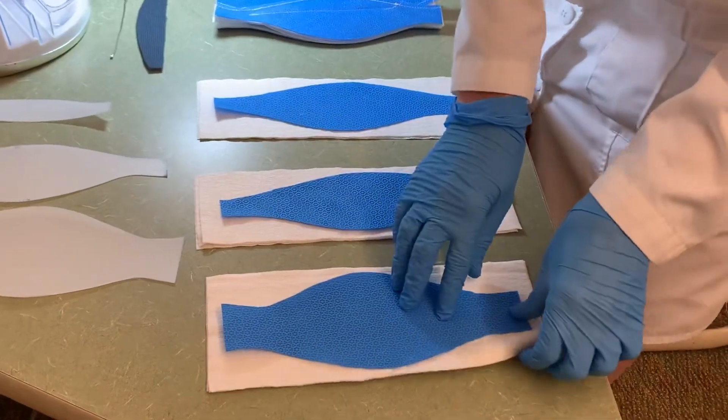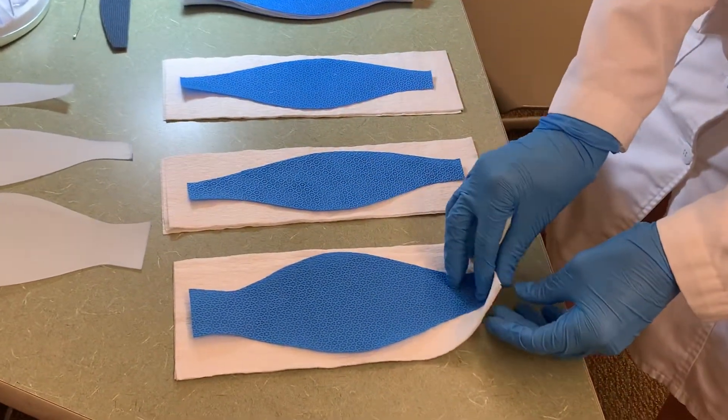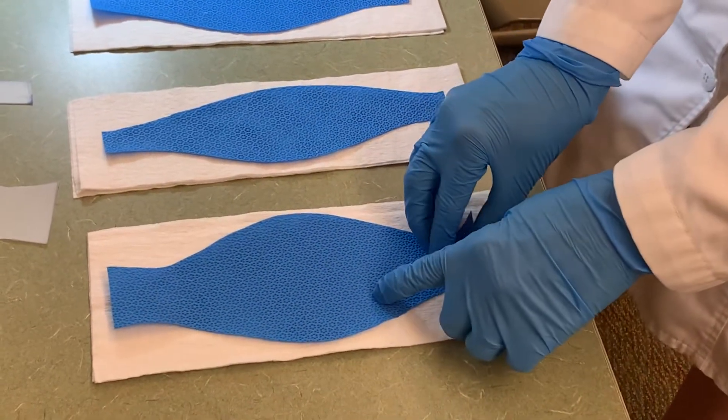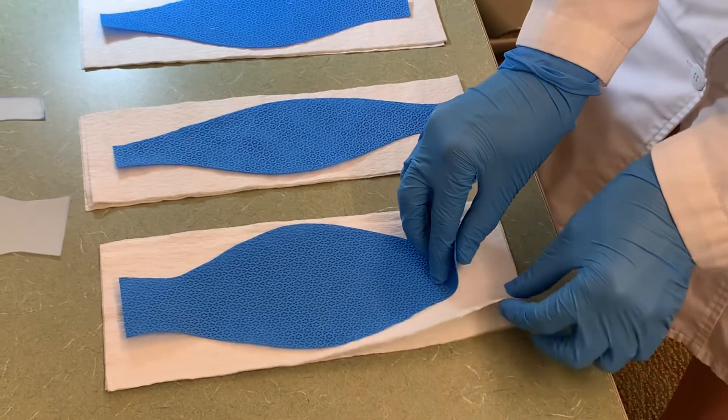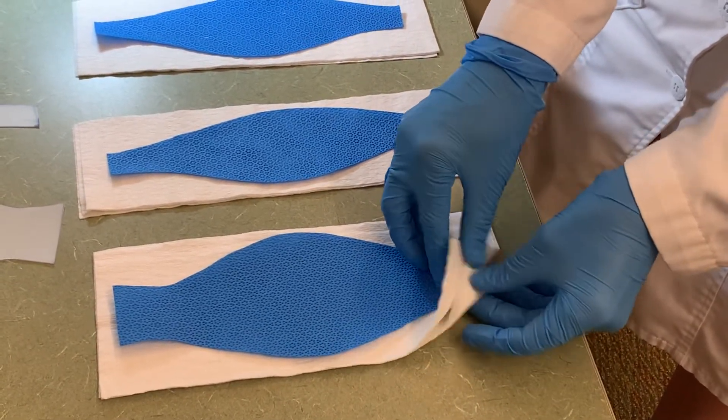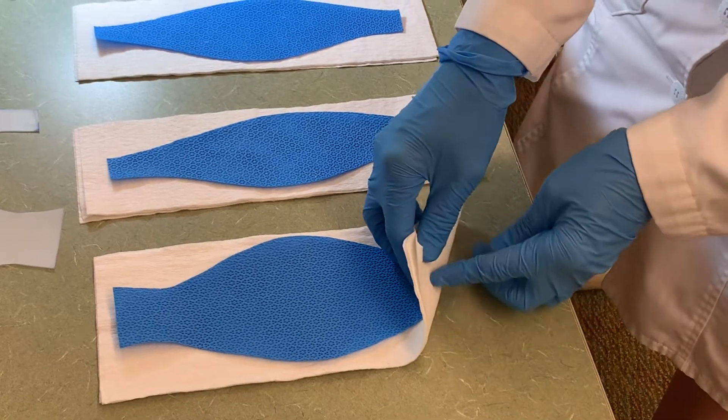Now each section has four layers total. There's the top layer which is a layer that has a liquid barrier. Then we have two layers for filter and then an inside layer that is against the face.